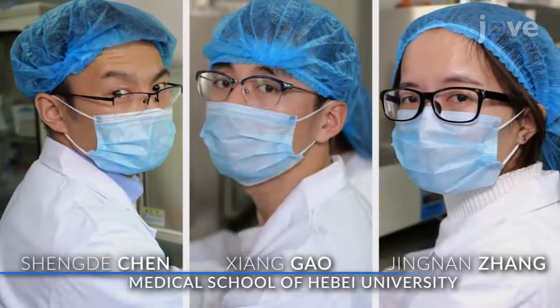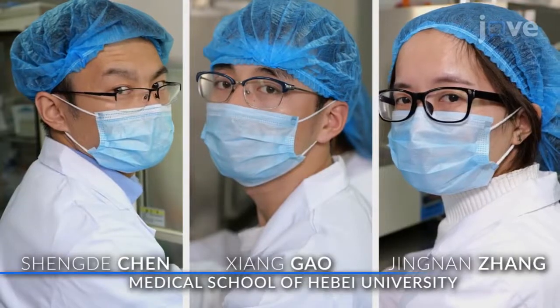Demonstrating the procedure will be Chen Shengde, Xiang, and Zhang Jingnan, the graduate students from my lab.